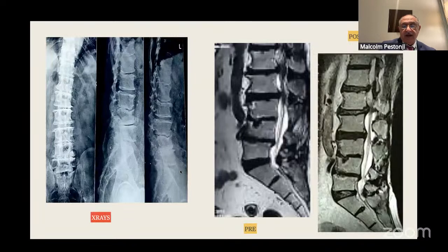If you see, there is mild scoliosis, quite a lot of stabilization, old surgery done at L3-4 with collapse, then L4-5 now collapsing. And at L1-2 and L2-3, the patient has subsequently developed stenosis. Post-operatively, you see we have done the flavectomy, central flavectomy over here, and decently opened up the cord.